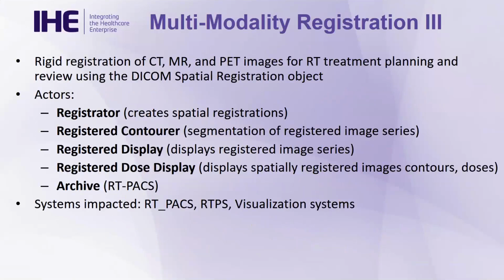And you might ask, well, why do you have all these separate actors? Because each one of these we consider a separate thing. Creating the registration and the specifications for what to do for that is different than displaying the registration, displaying the image series. So we have defined in the profile each of these items, and you can see the systems we believe that are impacted.